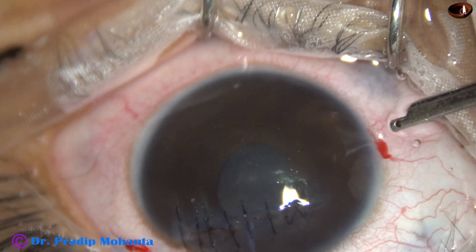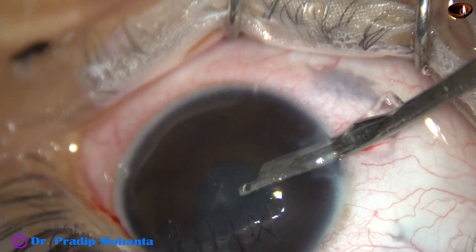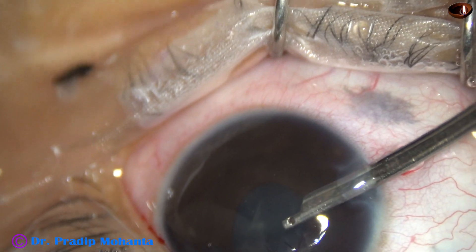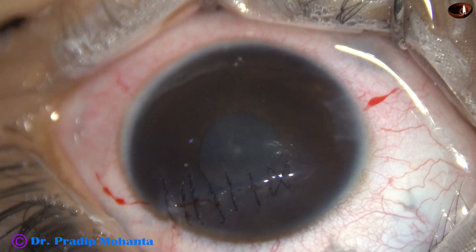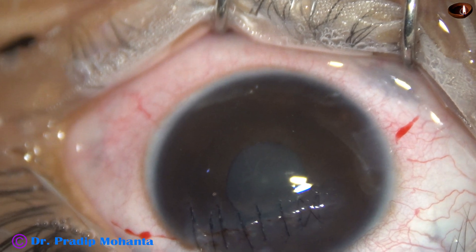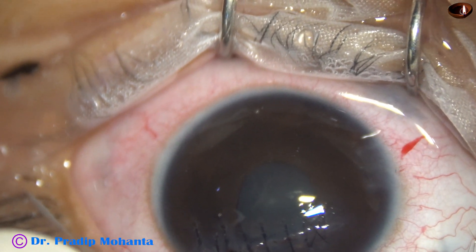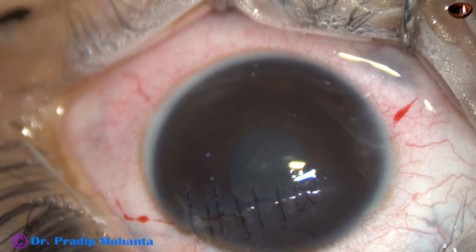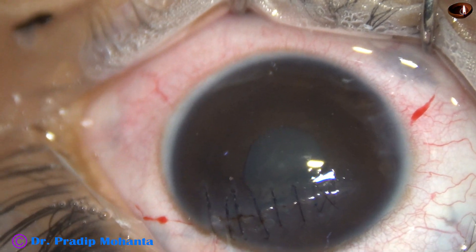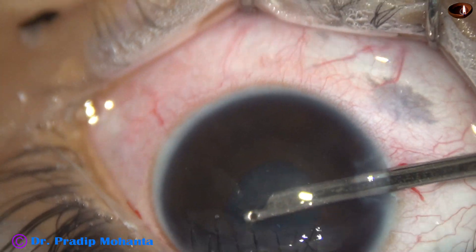Now, this is very important: we have to remove the visco as well as some exudate in the anterior chamber. After working for some time, I find there is some iris incarceration at the wound and I am not able to get there with the Simcoe. I took a spatula, shifted it, and the small knuckle of iris that got incarcerated got released — now it is okay. The exudate came out.